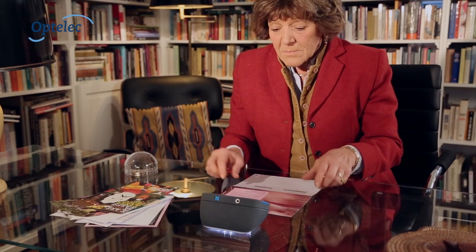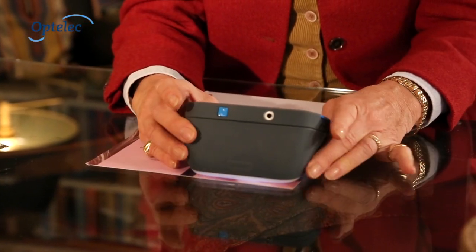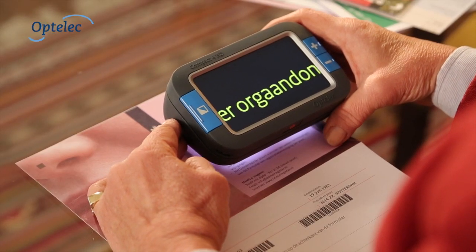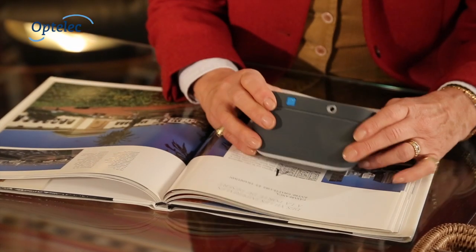The Optelec Compact 4HD is the first portable video magnifier which stylishly combines high definition image quality, ease of use, and a built-in magnetic stand for an optimal reading experience.